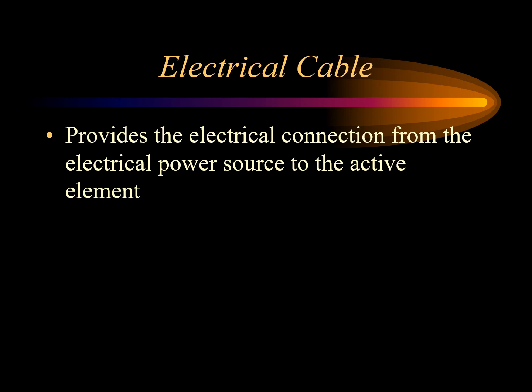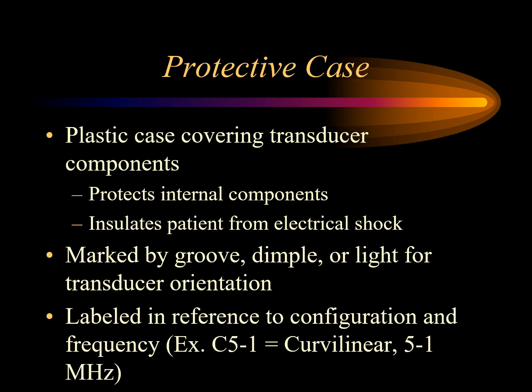First, the electrical cable provides the electrical connection from the electrical power source to the active element. The transducer has a protective case, usually made of plastic, that covers the transducer components. This helps protect the internal components of the transducer and also insulates the patient from electrical shock.